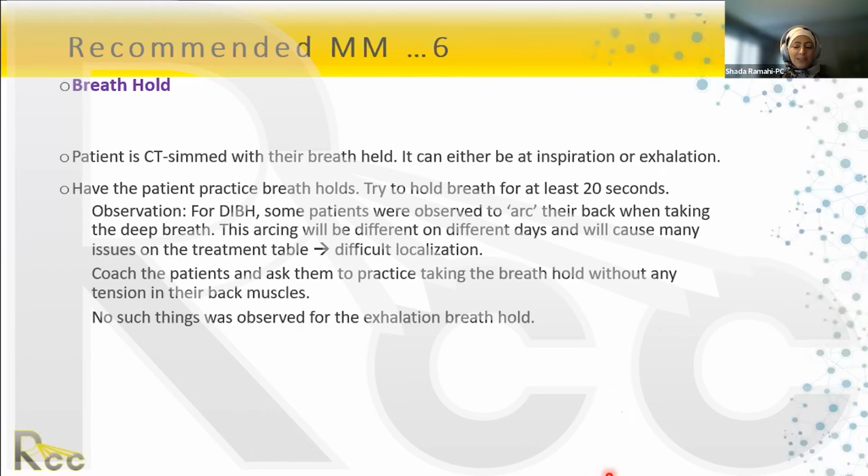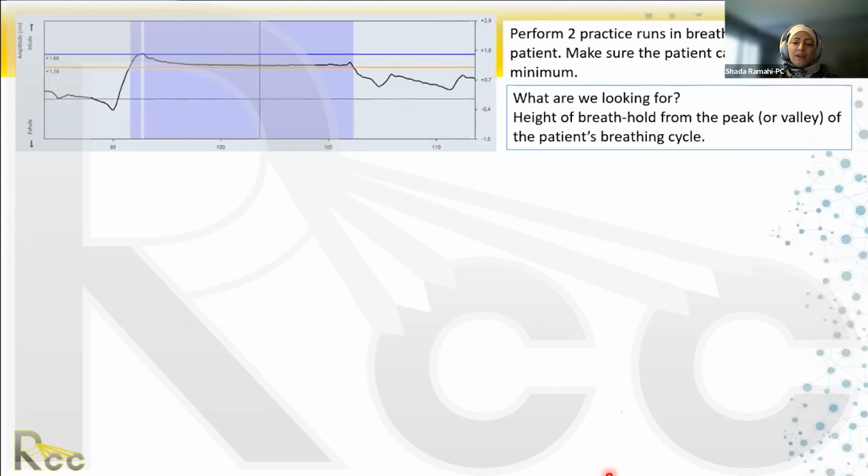And you have to teach the patient. If you're going to go with DIBH, deep inspiration breath hold, you have to teach the patient to take the breath in without arcing their back, and to relax. There's a lot of coaching, even for breath hold. When we're talking about breath hold, we still have this box or the bellows belt, depending on what you want to use. And you also need to do a practice run with the patient.